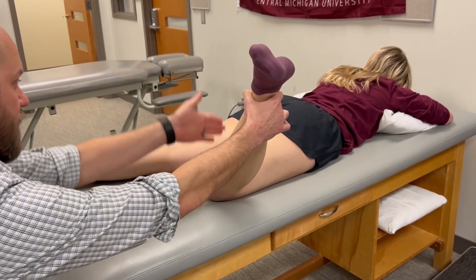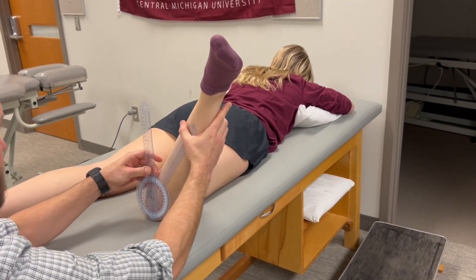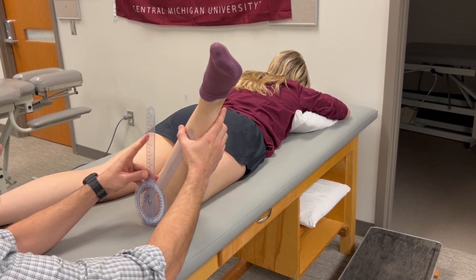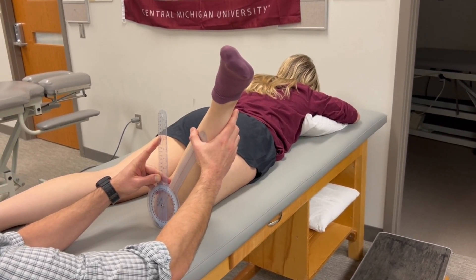Our reference is the vertical line, so I would say about 35 degrees. While maintaining that end range position I can take my measurement — reference is going to be parallel with gravity, and the indicator is parallel with the anterior midline of the leg.